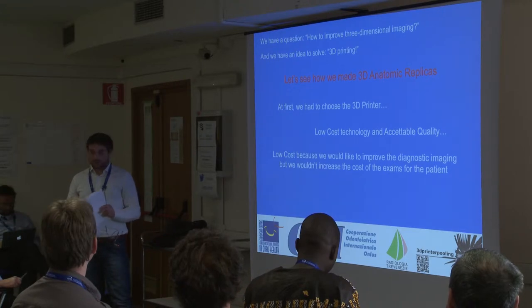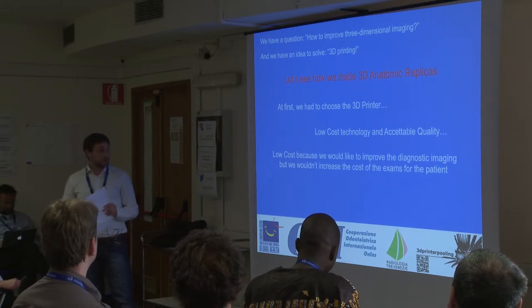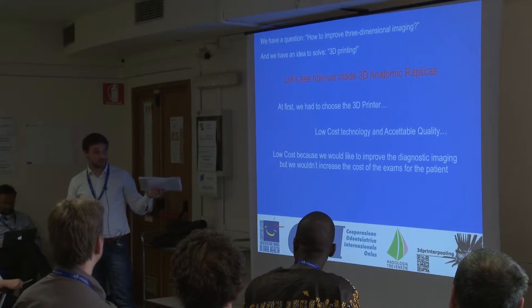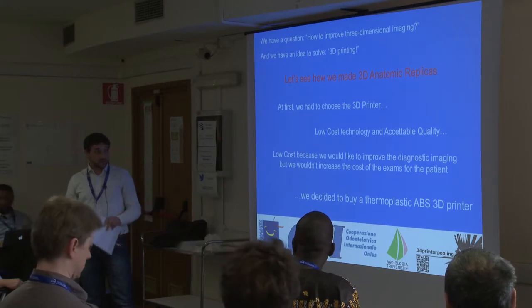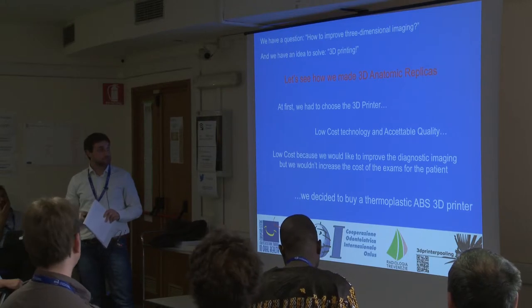Low cost technologies, but with acceptable quality. Low cost because we would like to improve the diagnostic image, but we wouldn't increase the cost of the exams for the patient. We decided to buy a thermoplastic ABS 3D printer.